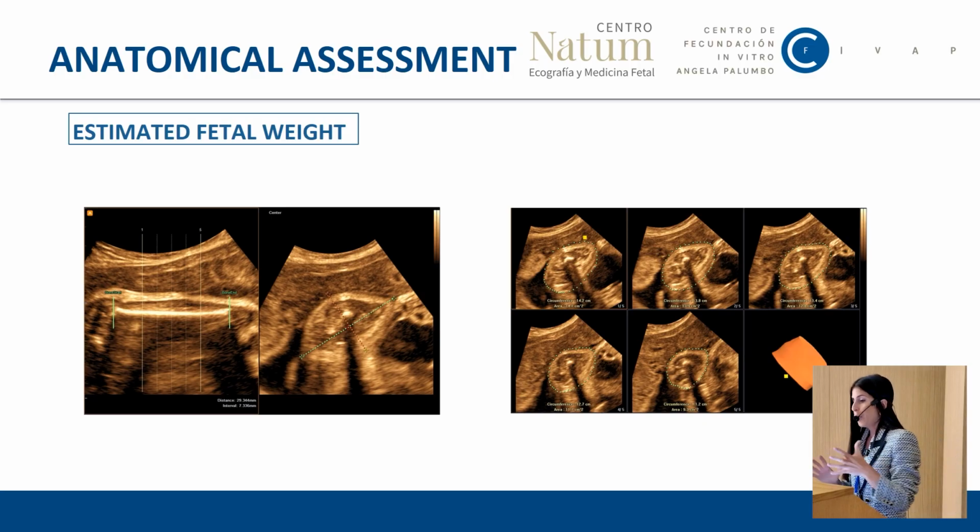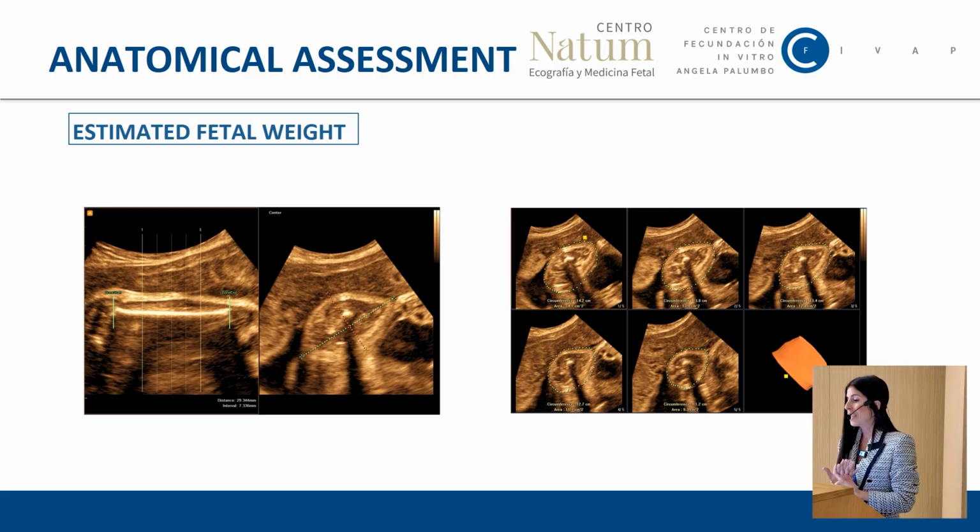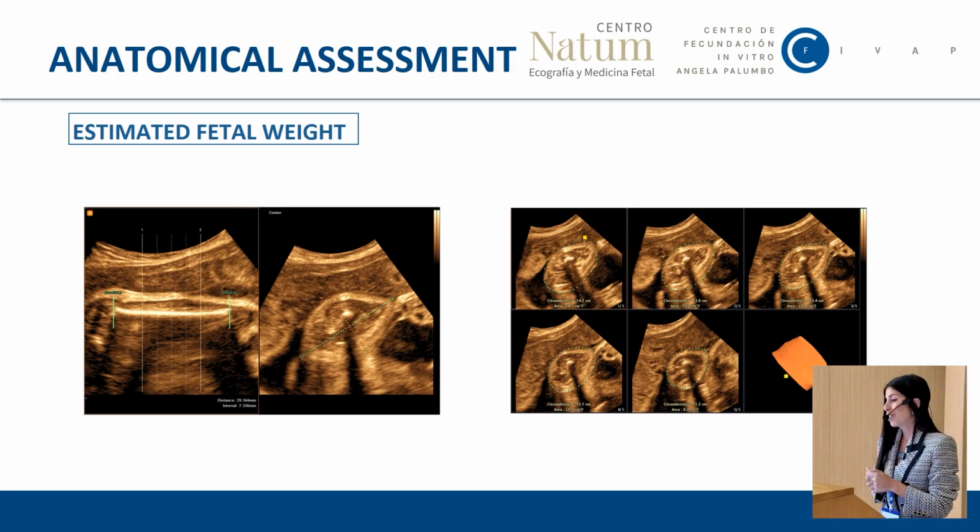We know the accuracy of standard fetal weight estimation remains low, so in anatomical assessment it's been studied that the 3D ultrasound of the femur volume has been shown somehow a potential predictive value in fetal growth restriction. 3D ultrasound has also been applied to fetal weight estimation and evaluation of fetal nutritional status in an attempt to improve the existing nomograms for fetal weight and fetal biometry.